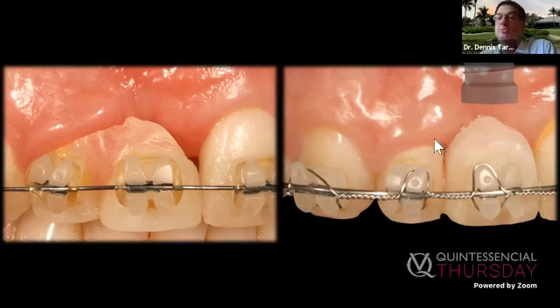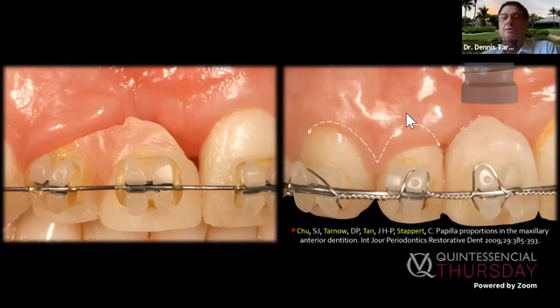Now, always do your advancement first; don't put your graft or your implant in first. Always bring your papilla down first. Why? It gives you blood supply. Then leave it alone and do papilla sparing incisions. So don't just put the graft in first. Never do that. Always bring your tooth down orthodontically. It builds up blood supply right in here. Then you can have an easier surgery for the graft.